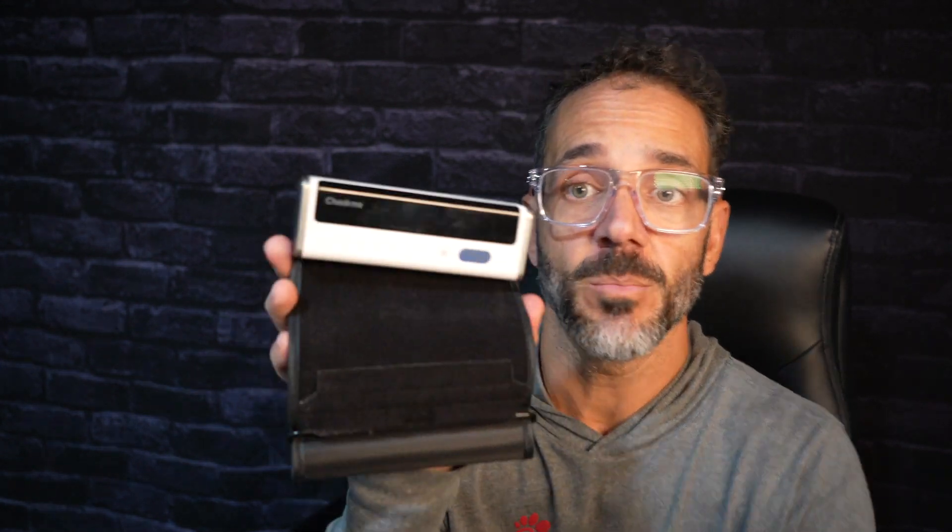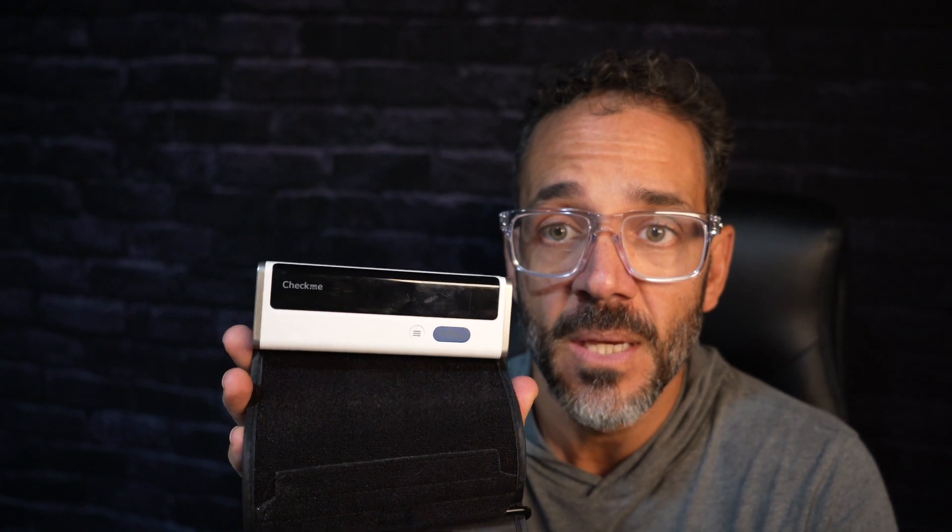Hello there. If you're watching this video it's because you're thinking of purchasing this blood pressure cuff by Check Me. I've had it for about a year and a half. It uses USB-C charging, so it charges for a long time. I placed it in a drawer for months and the battery stayed up.